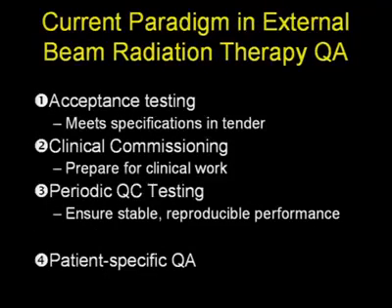So having presented an overview of these technologies, I will go through the classic paradigm for quality assurance as can be applied to these new devices. So just following the guidelines from the AAPM TG40, one can have a generic quality assurance paradigm that can be applied to any technology.